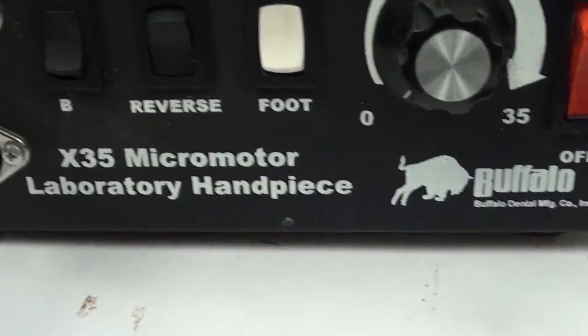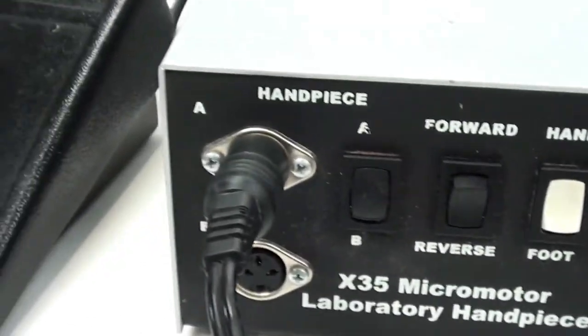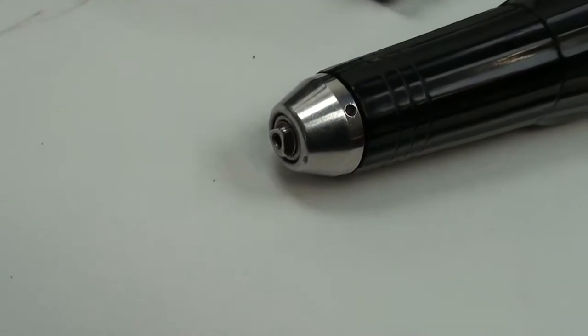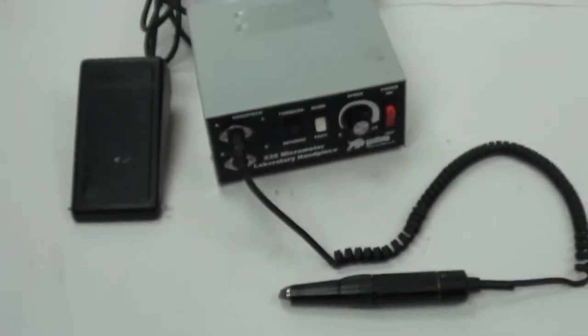You can see there it's Buffalo X35. You've got the handpiece plugged in there. Now we'll go ahead and demonstrate how this machine works.